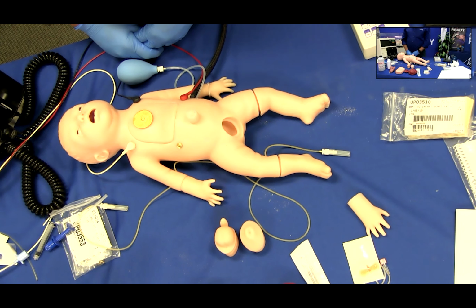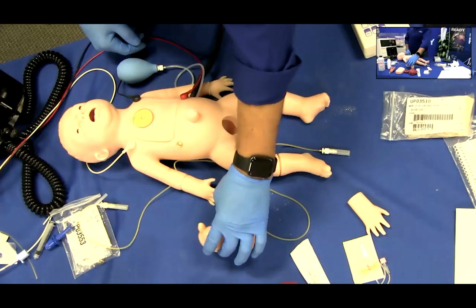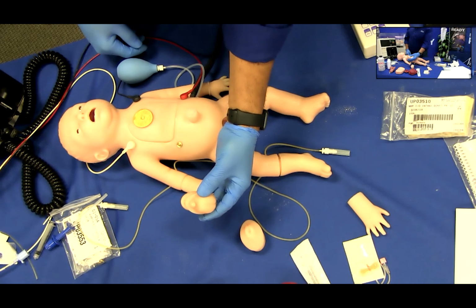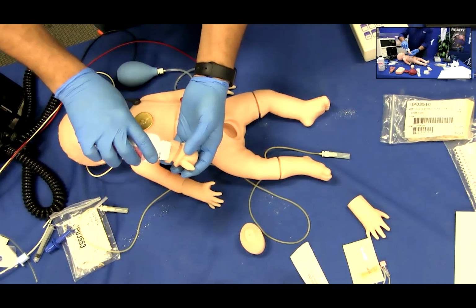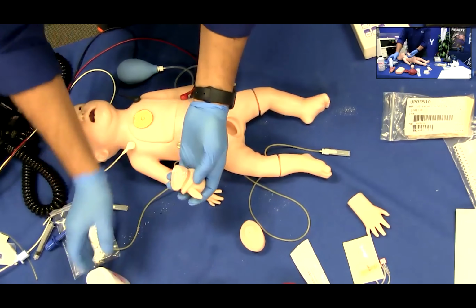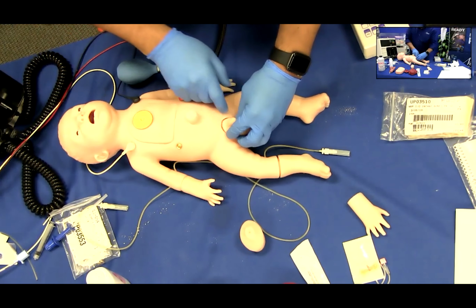To interchange and install the genitals, select either the male or female genital. Apply a dusting of baby powder to the back side of the genital insert and slide the insert into place in the infant simulator.